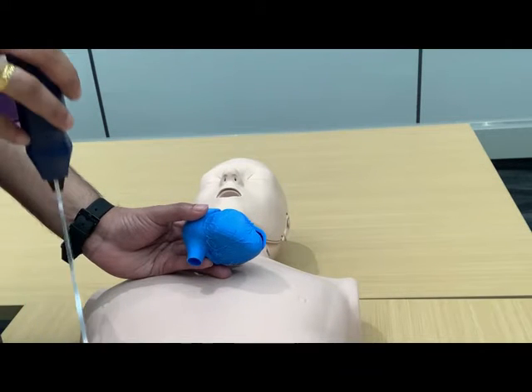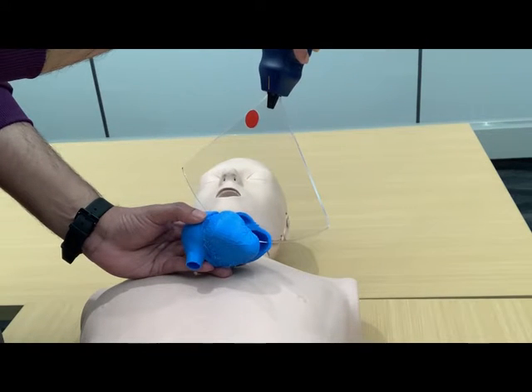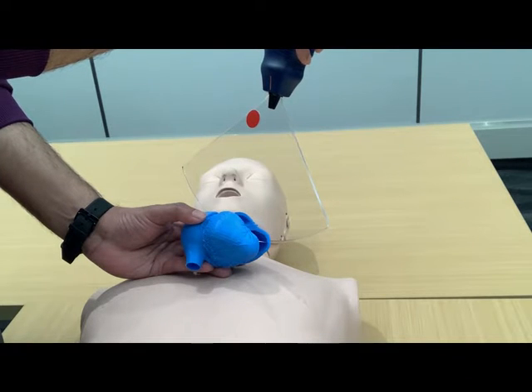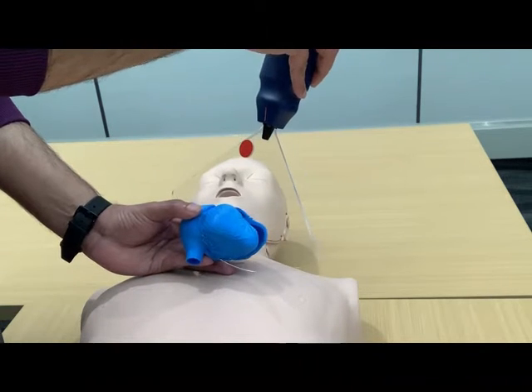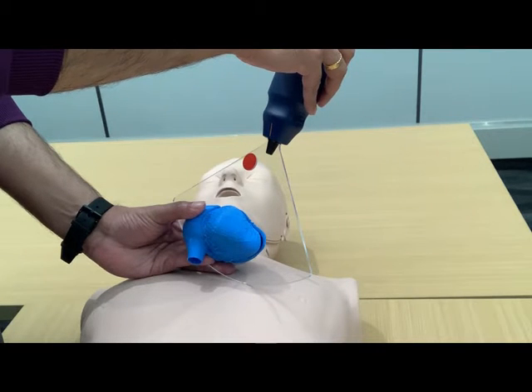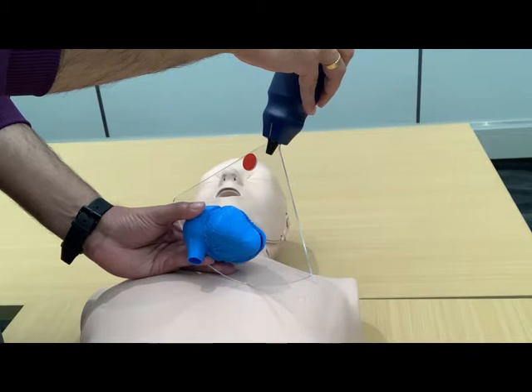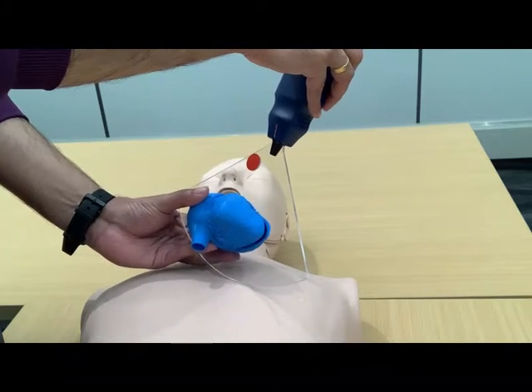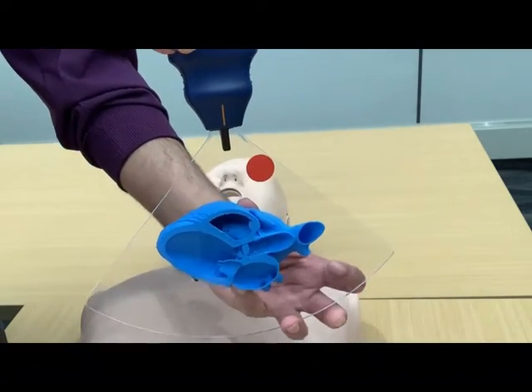To obtain a parasternal long axis view of the heart, you place the transducer in the third or fourth intercostal space with the orientation marker towards the patient's right shoulder. We are doing that because the long axis view of the heart is oblique in relation to the long axis of the body, and the beam goes from anterior to posterior. Structures closer to the transducer will be depicted on the top of the image, and structures farther from the transducer are depicted at the bottom. When the beam goes like this, you slice the heart in its long axis and this is what you will see on the ultrasound screen.